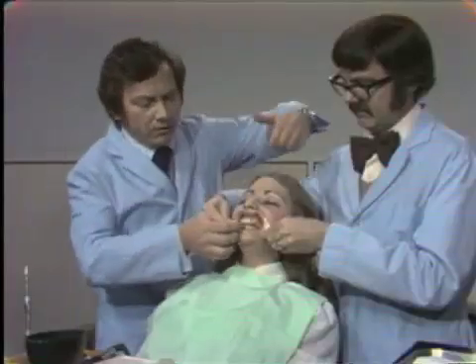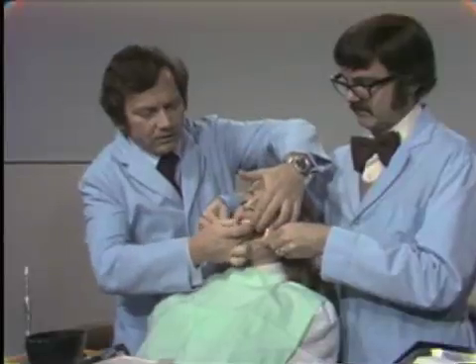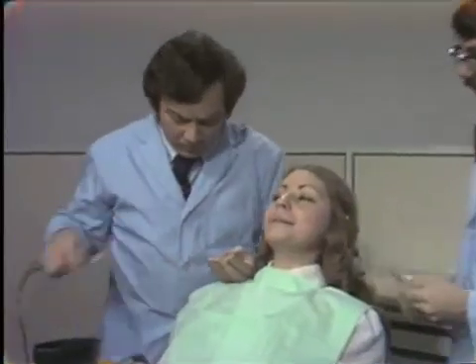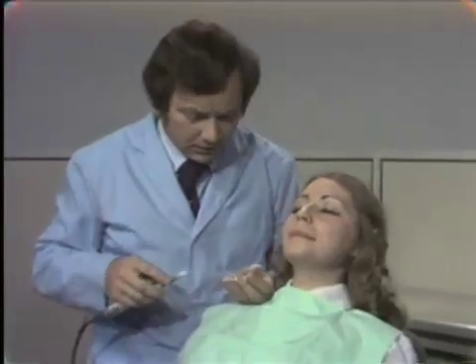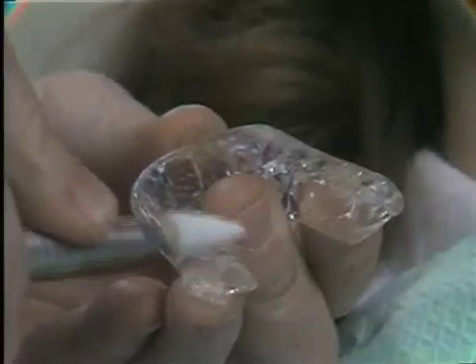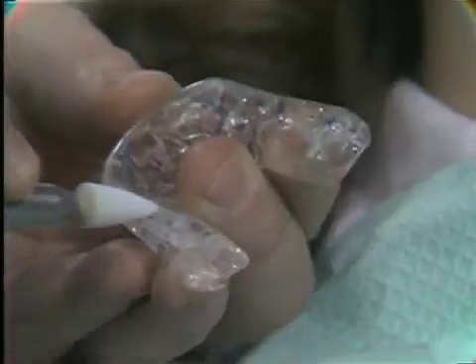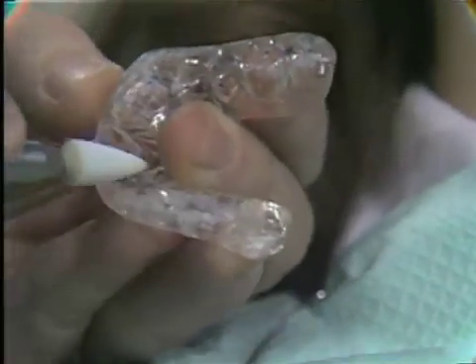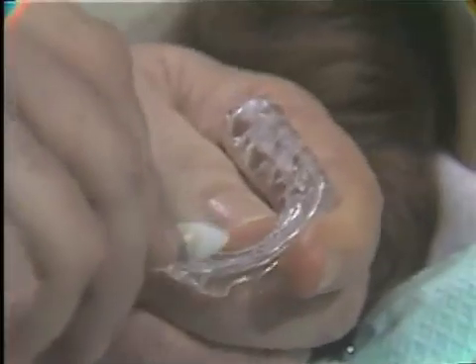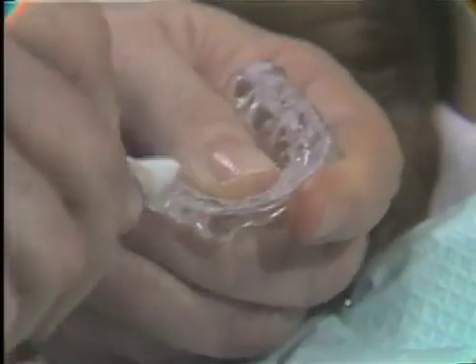Now remove the acrylic splint — notice how it clips out. Have a look at the marks on the occlusal surface. At this stage, we have to adjust until these marks just become pinpoints. In this particular splint, due to the care in waxing, we have very little adjustment to be done.